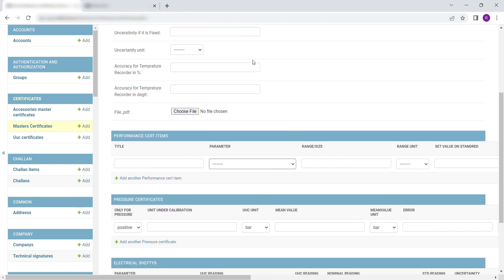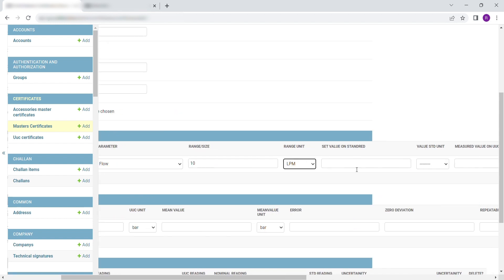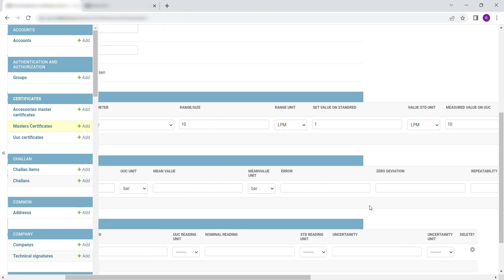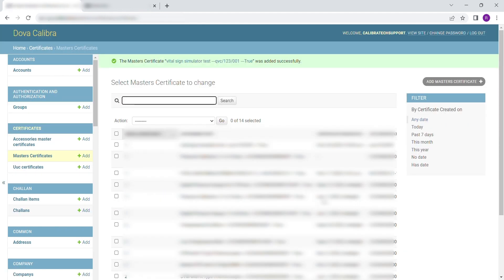In Performance Certificate Items, enter the Title. Select Parameter. Enter the Range and Size. Select the Unit. After filling in the essential details, click on Save to save and exit, or Save and Add Another to continue entering Master Instrument Certificates.